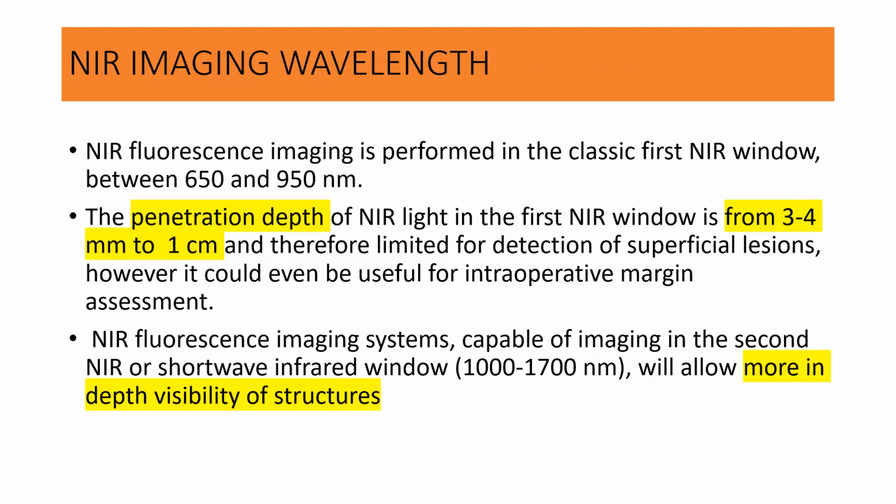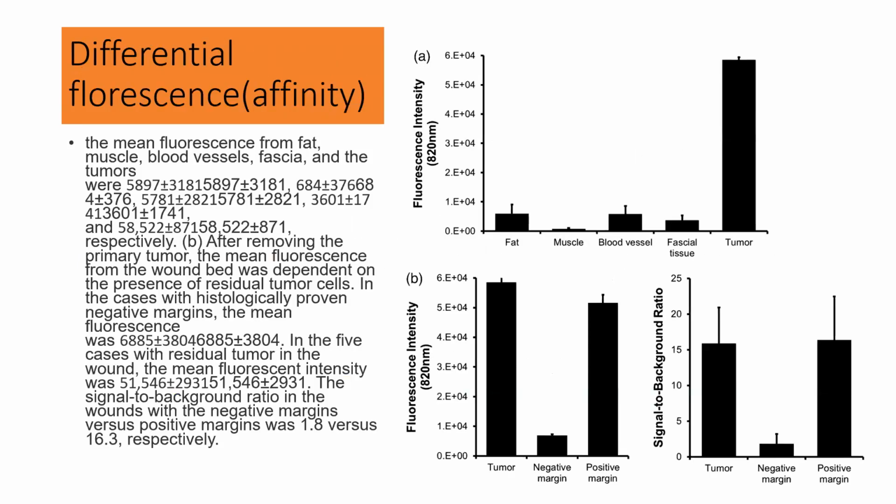But in certain handheld camera systems, we can see the dye around 1 centimeter below the skin margin. So that is important. Therefore, in many surgeries, we have to skeletonize to see the particular anatomy, because if a lot of fat is there above the pathology, then we have to skeletonize it to see the ICG dye. So for seeing the depth, we have to skeletonize it.